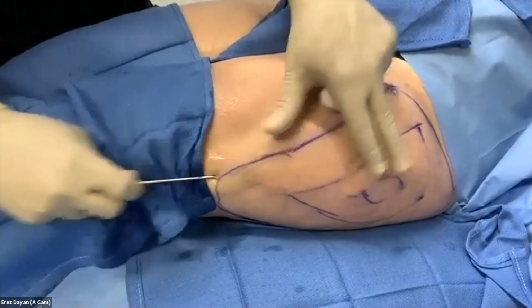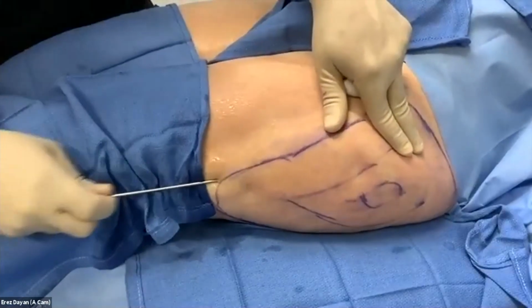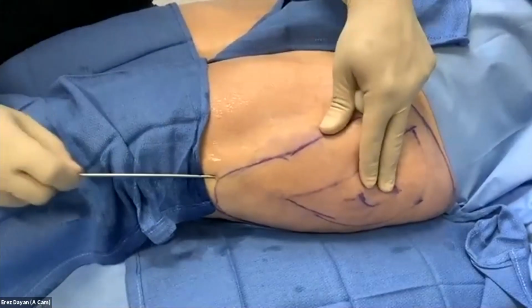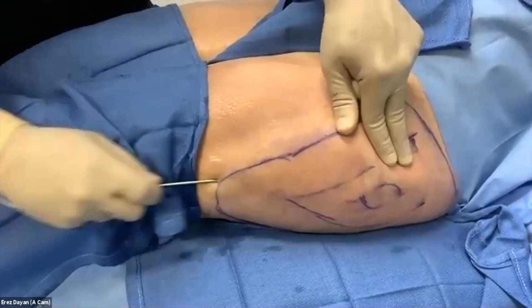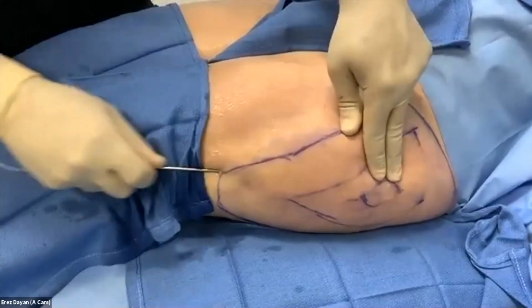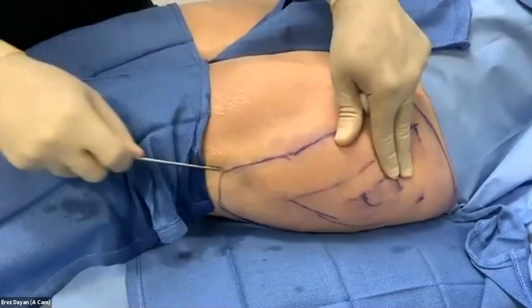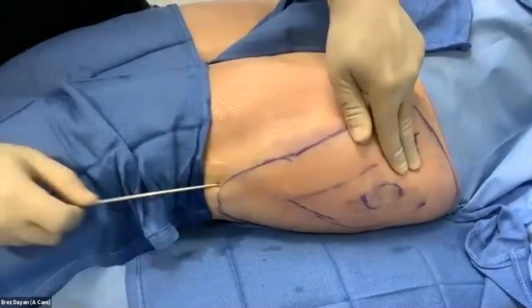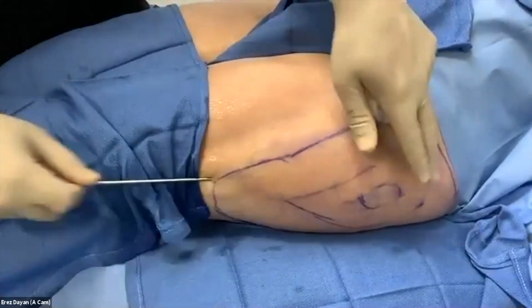So you feeling any of that? Yeah, this feels weird. Feels weird, right? Some people feel ticklish, which is good. I mean, it's not good, but it's better than pain. The nice thing is this accomplishes two things. These passes allow me to test my local, they allow me to spread it out a little bit, and they give me a feel of how much fat there is here and what I need to do.